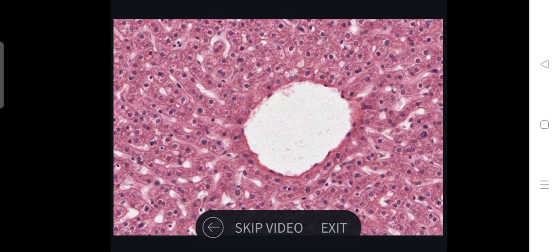To facilitate this endocrine secretion, the expected basement membrane of both the endothelial cells lining the sinusoids and the hepatocytes themselves is absent. And without this glue, a narrow space called the space of Disse develops between the two epithelia. But again, this is not resolvable in this image.